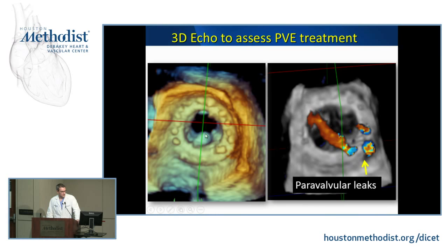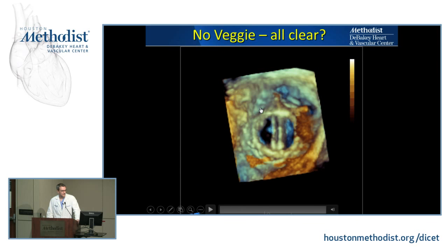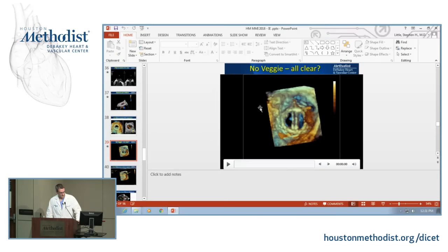And that's sort of an example. And see the sort of lumpy bumpiness to this prosthetic leaflet, that is what happened with the endocarditis. And these are the three new defects that the bacteria created.